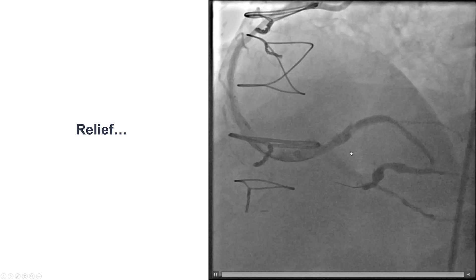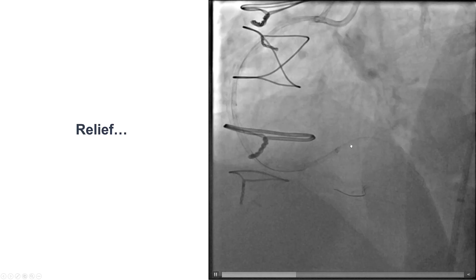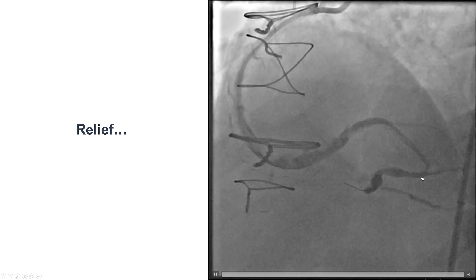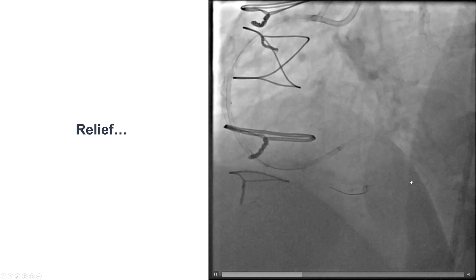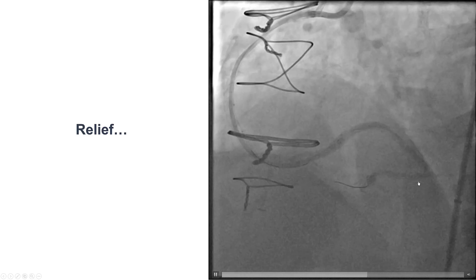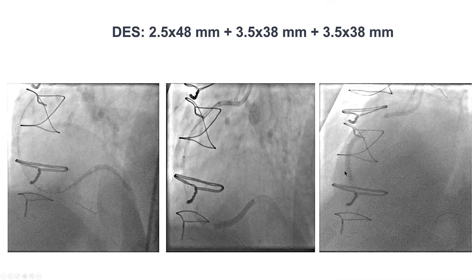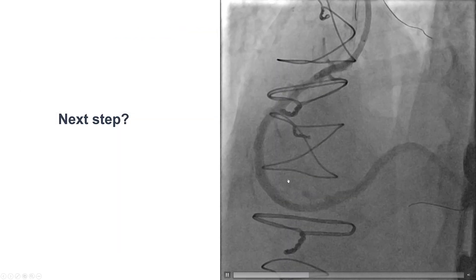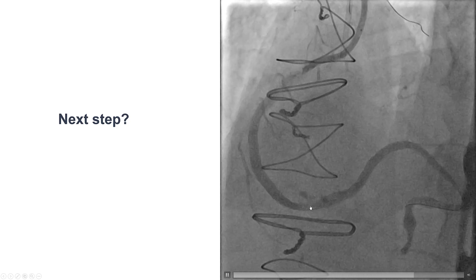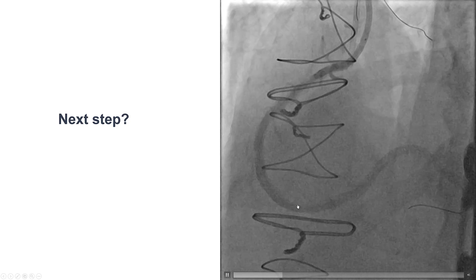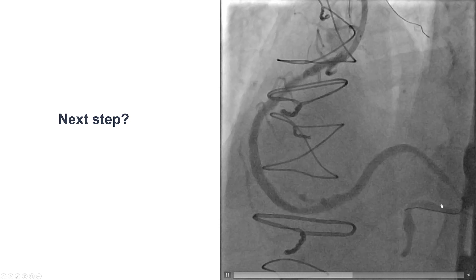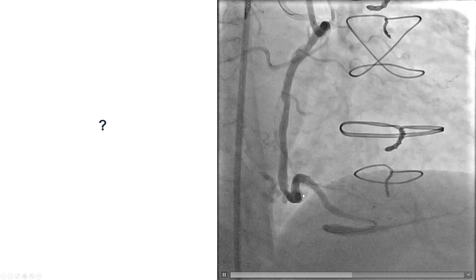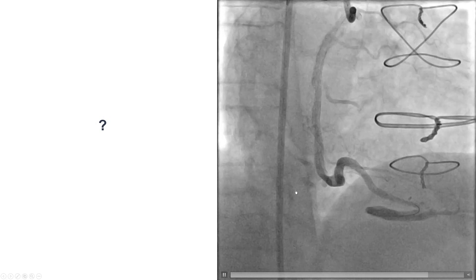That was obviously a big relief given the adverse consequences if we had been unable to do so. The question then became whether to stent the distal touchdown of the vein graft. We decided against it — which, as we would see, was not the right decision. We placed three drug-eluting stents almost all the way to the proximal right coronary artery and then did another injection. Now we had another problem: we saw what initially looked like another bypass, but it didn't make sense given the skip segment visible here. An RAO injection of the right clearly showed we had another perforation in the distal right coronary artery.